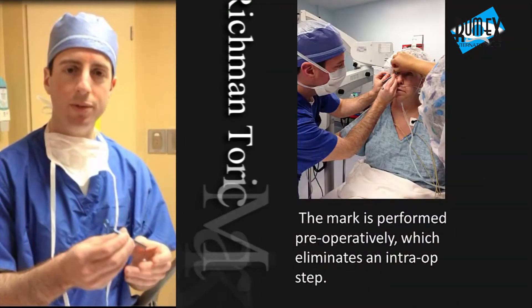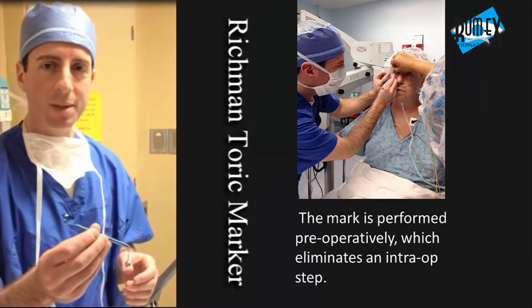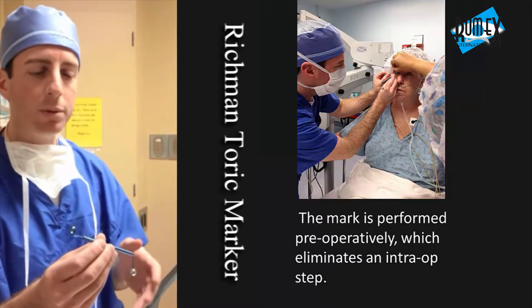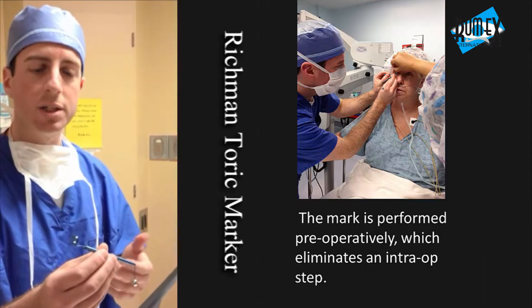Richman Toric Marker. What we've done with this design is try to make a single-step toric marker, to avoid having to mark once pre-op and then again in the operating room, to try to get it more accurate and with less chance of error.